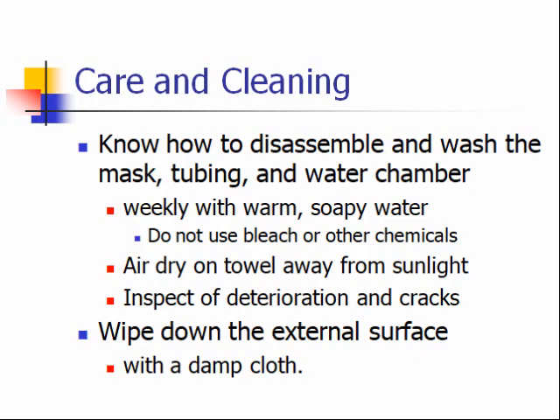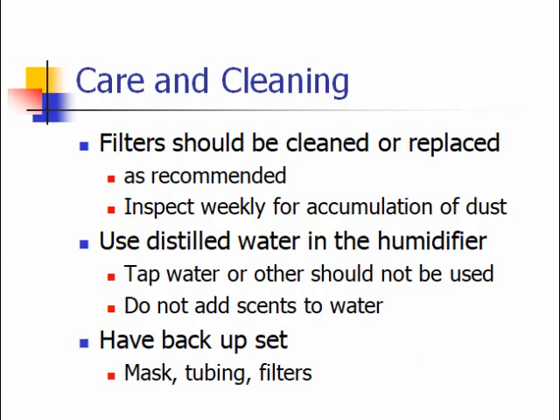Look at the equipment on a regular basis and check for deterioration or cracks. And if those are showing up, then get a new unit. You should wipe down the external surface of the CPAP device with a damp cloth. Filters should be cleaned or replaced as recommended by the manufacturer of the CPAP device, but do inspect them weekly for accumulation of dust. Sometimes that's all you need to do is clean a bit of the dust away.